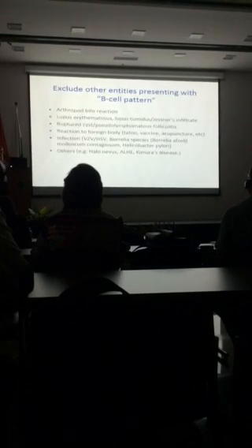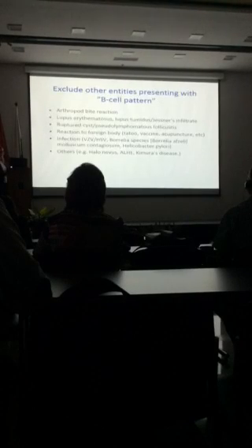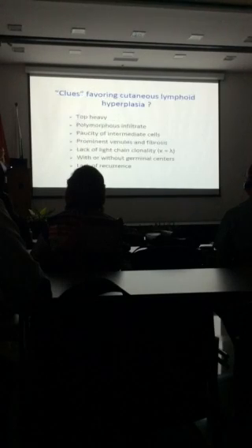I haven't seen it really here in this country, although I check Lyme titers regularly. And then others, halo nevus with an exuberant lymphocytic reaction. Sometimes with these follicles you can consider angiolymphoid hyperplasia with eosinophilia or Kimura's disease.